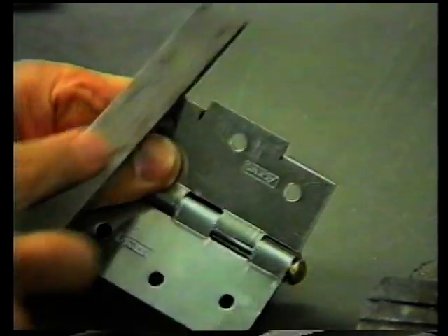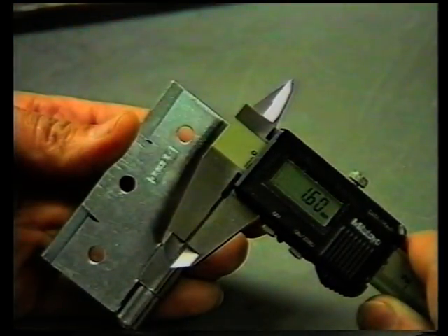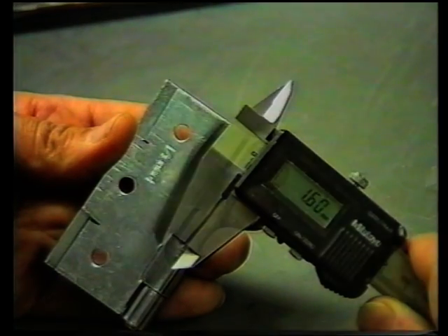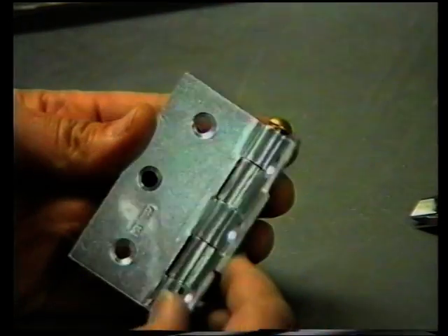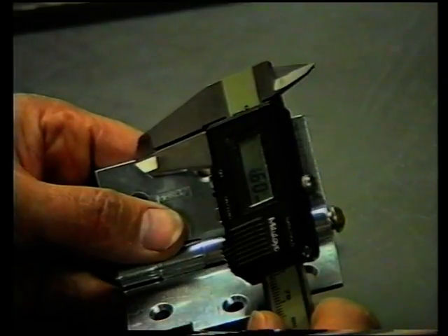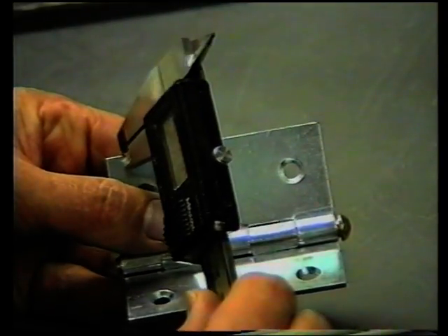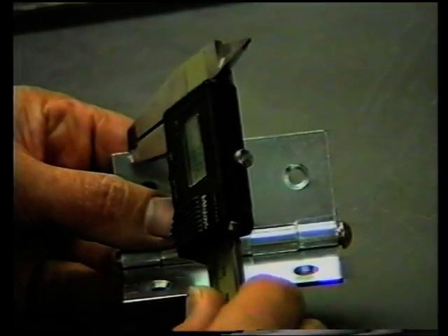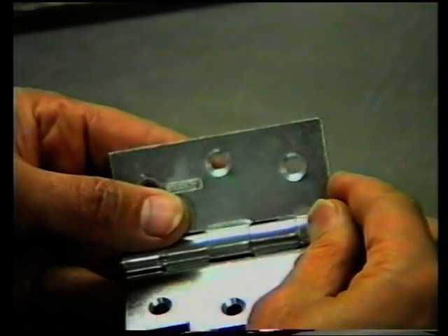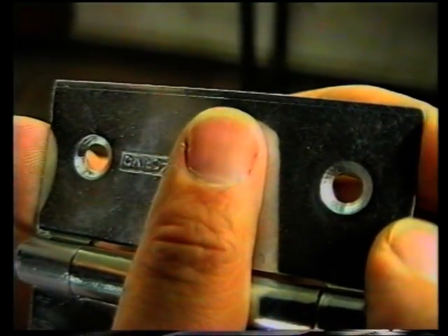The burr is taken off. The width of the piece cut off is 1.6 millimeters. We are measuring the width of the size to be broken off: 1.6. A line is carved into the door hinge to regulate the width of the blade cut.